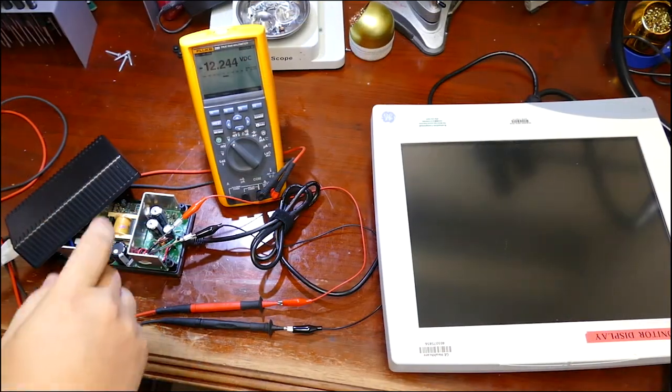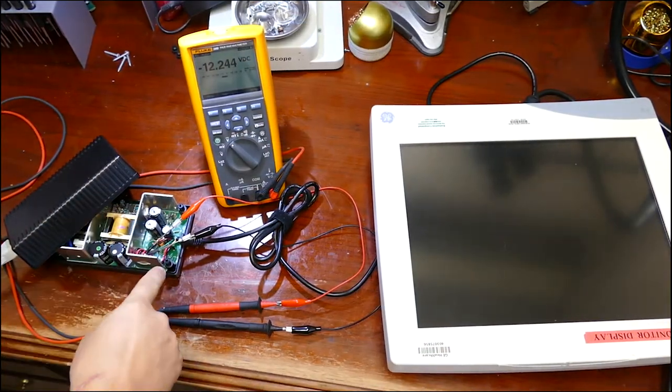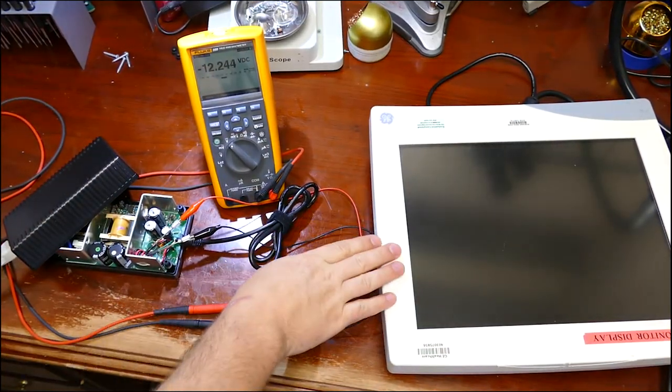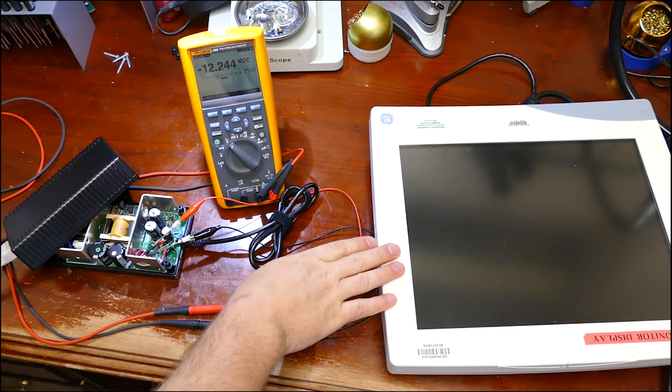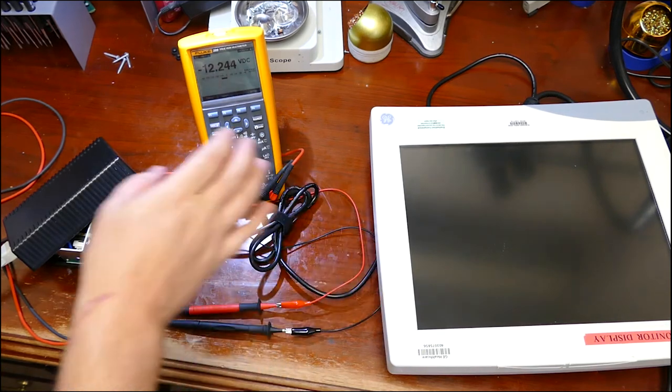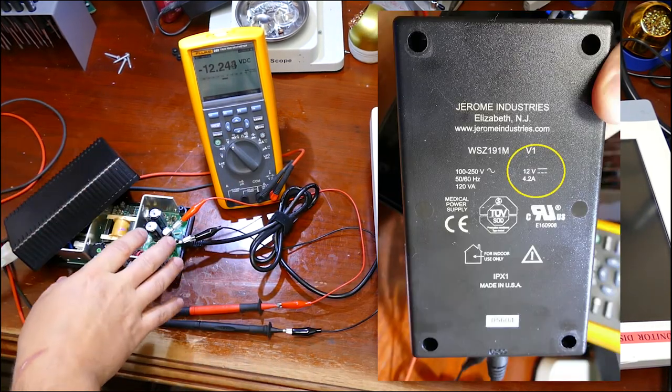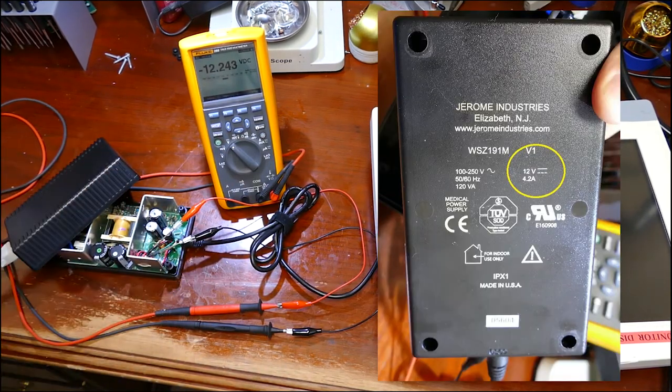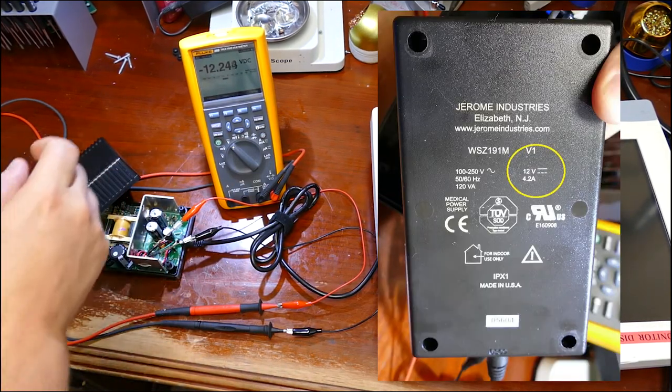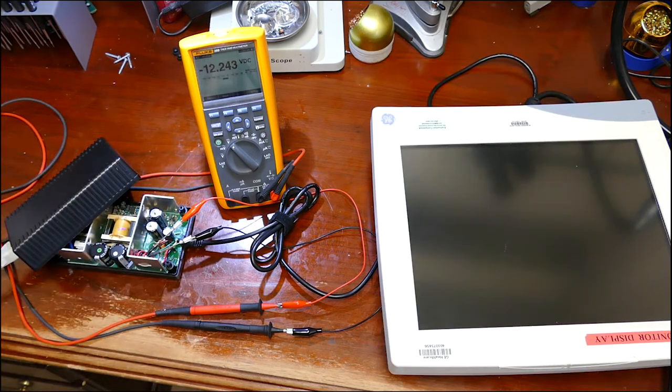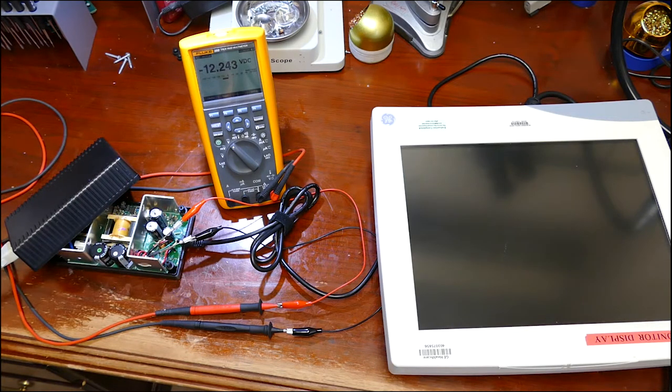So this is a perfect example of it in real time with a real piece of medical equipment. Now what I have here is a DC power supply for these GE touchscreen monitors and it's rated at 12 volts 4.2 amps. And as you can see on the meter, it's putting out 12.24 volts DC.